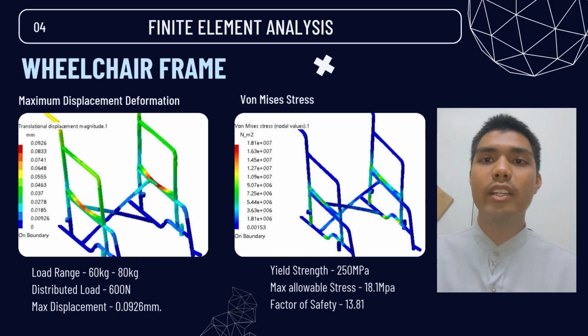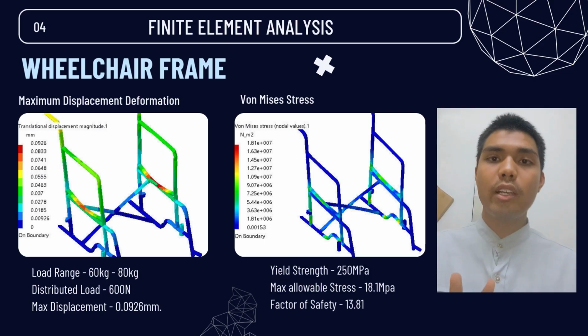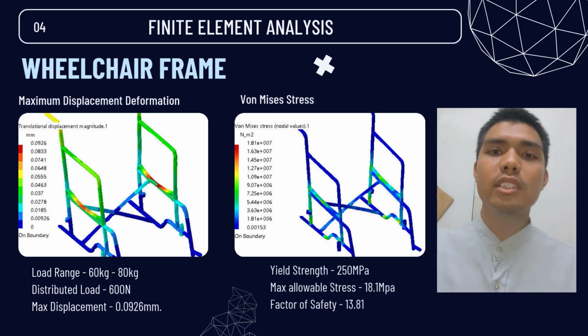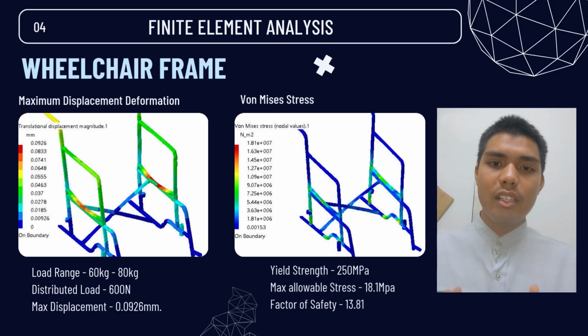Now we continue on the finite element analysis. For this analysis, we choose two parts, which are the wheelchair frame and the rear wheels. For the wheelchair frame, we apply the load where the seat connects to the frame. If the person sits on the wheelchair, both the right and left steel bars at the frame have force applied. So we choose that section part where they apply load.